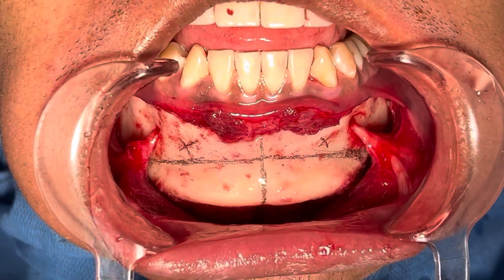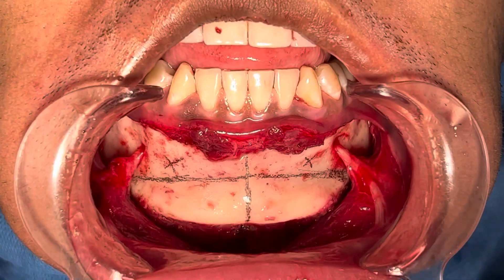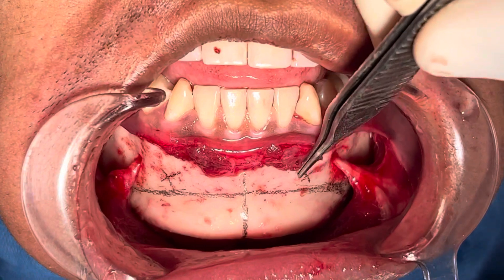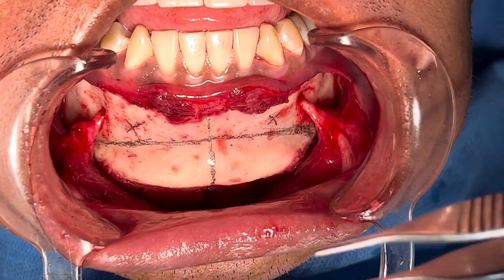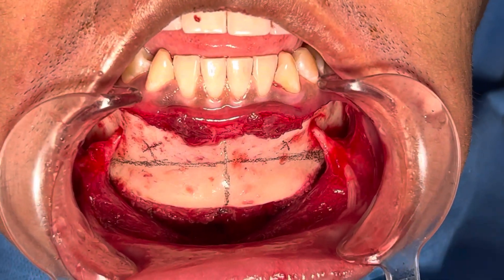We've exposed the chin and we're doing a chin augmentation. I've done the marking for the osteotomy and also the planning for the distance from the apex of the teeth and the mental nerve. Here we have less height of the bone, but we're going to do both vertical and horizontal augmentation.